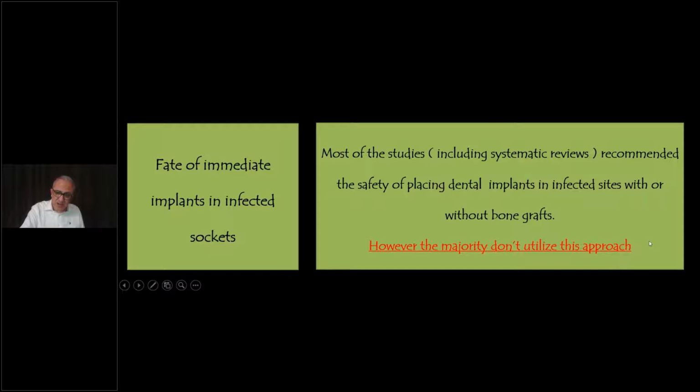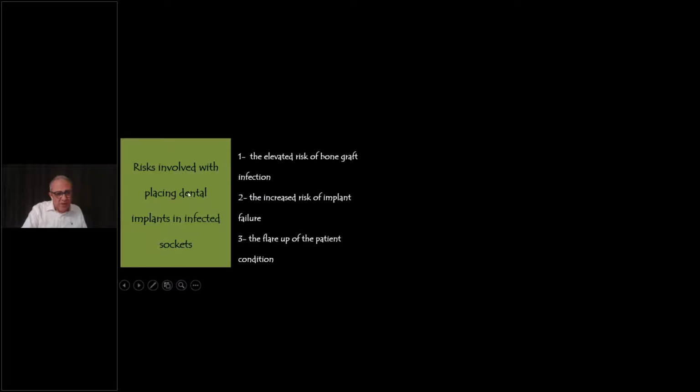But the question here is, I'm not sure that any of us is doing this. I'm not sure I can do that. I'm sure that Dennis wouldn't do that. Dr. Tarnow, I'm not sure that he will do that as well. Because we have risks involved with placing dental implants in infected sites. First, elevated risk of bone graft infection, the increased risk of implant failure, the flare-up of the patient's condition.